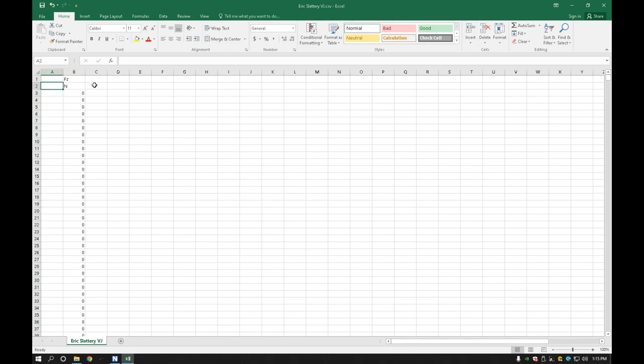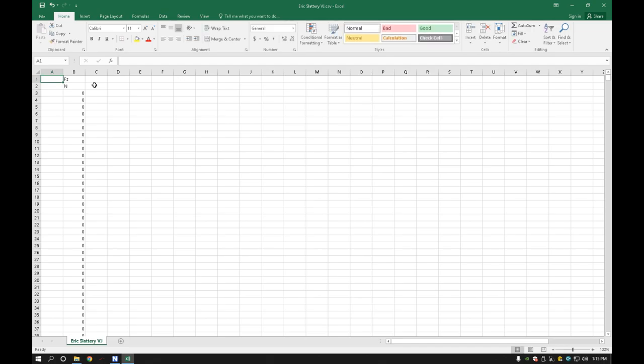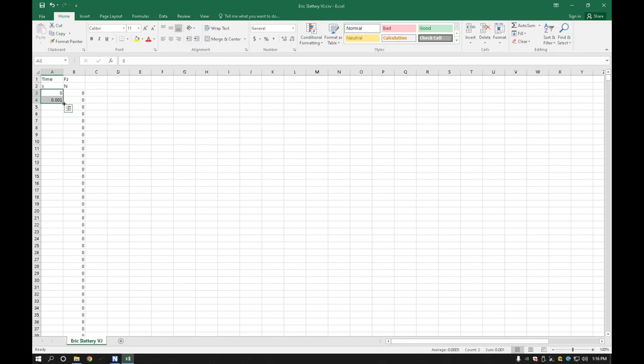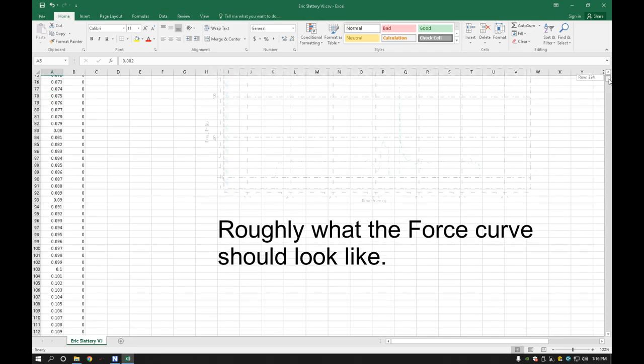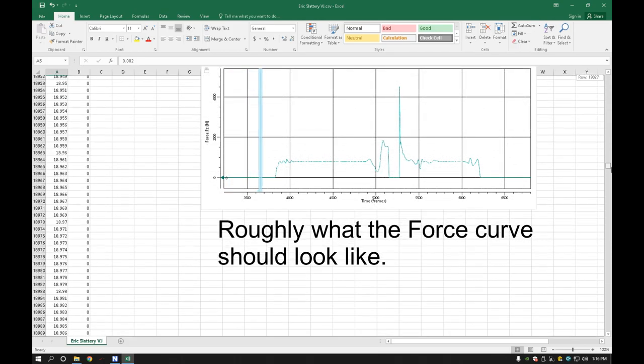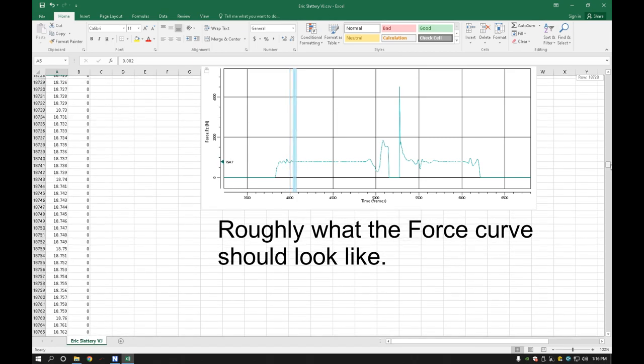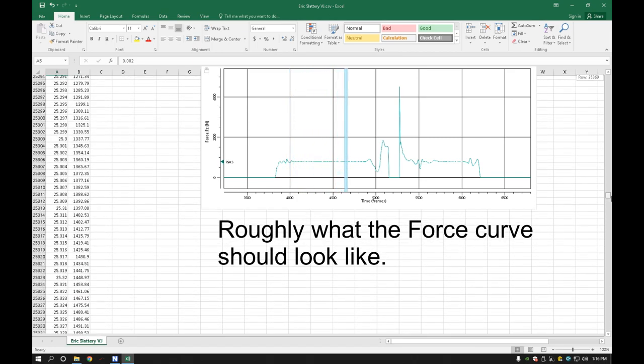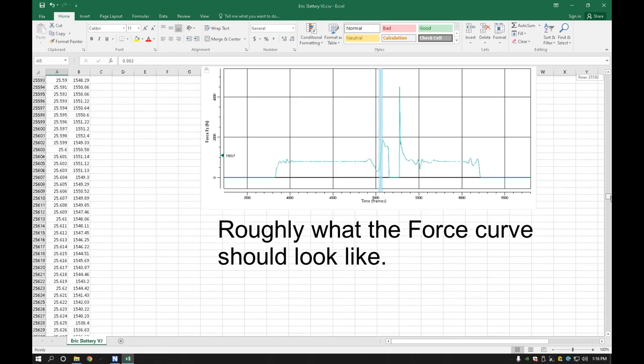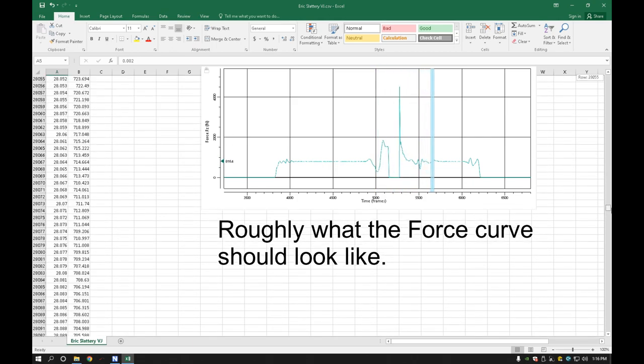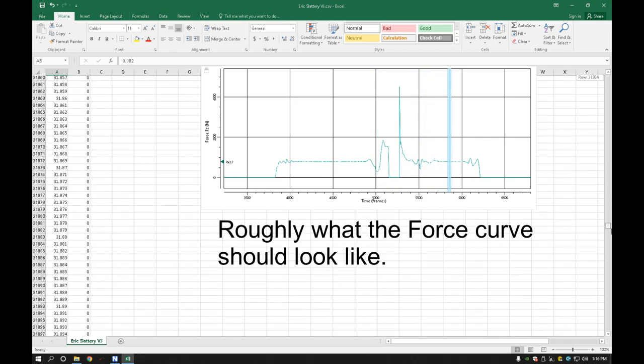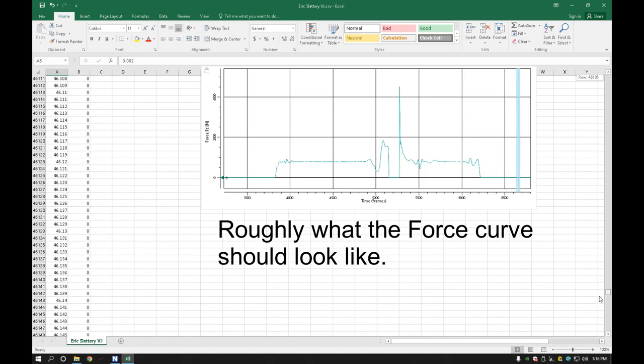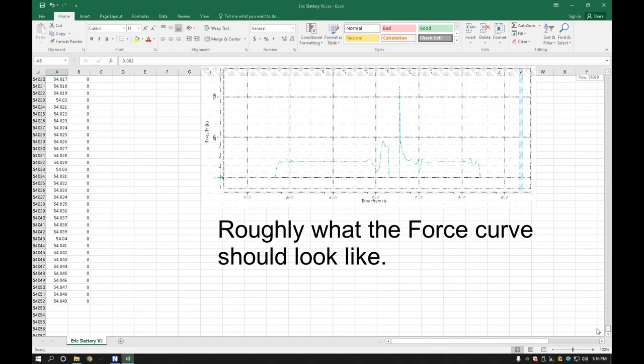When they actually get to it, they'll do zero. This will be the time. That will be in seconds starting at 0.001 and so on. So, easy peasy. Then they'll have to go ahead and on through. Let's just take a quick look through it to make sure we got our data. Okay, yep. We see our data there, standing still. Then the jump. Okay, zero again. I'm off the force plate, and I'm on again here. And then I'm off, because I had to do this for demonstration purposes of walking on and off and such.